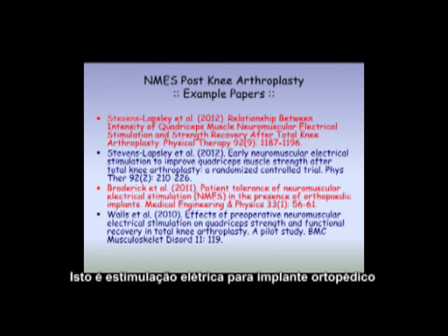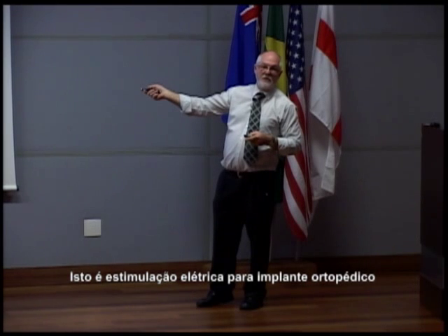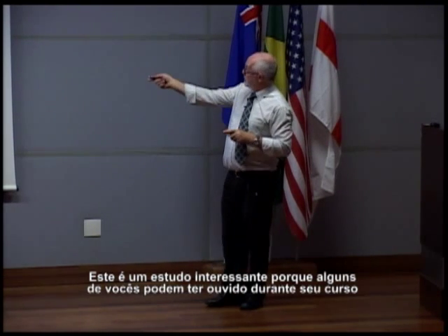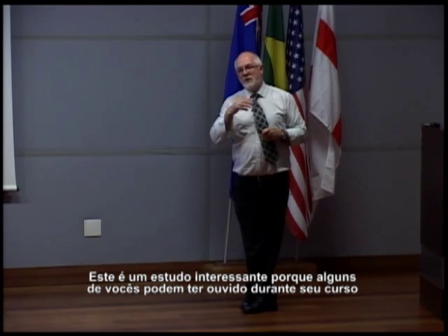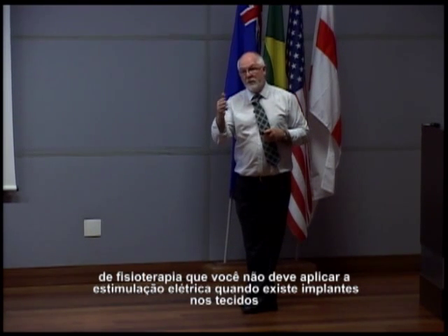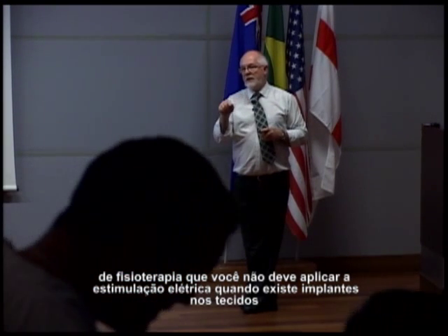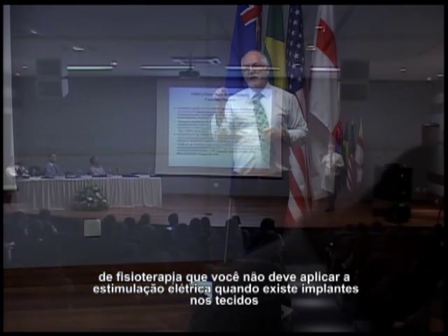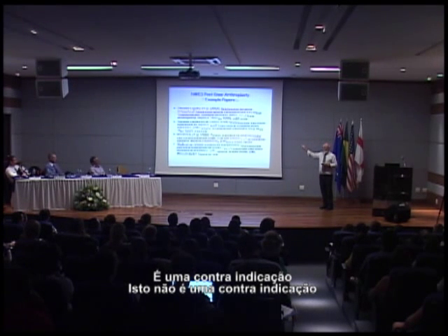This is electrical stim for orthopedic implants. That's an interesting paper because some of you may have been told when you did your physical therapy or physiotherapy training, you must not do electrical stimulation when there is metal in the tissues. It's a contraindication. It is not a contraindication.